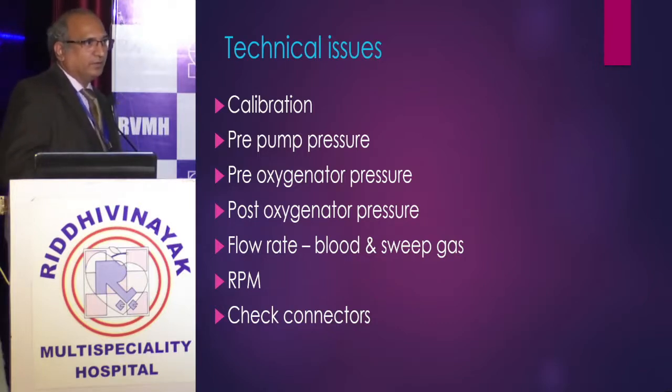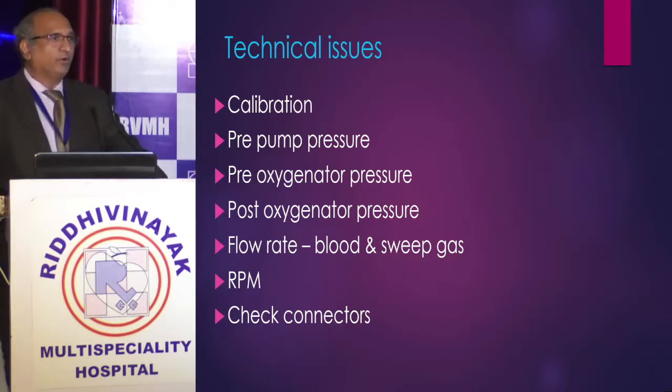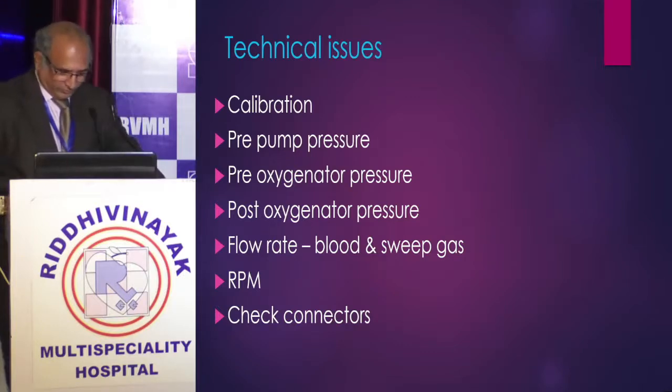So first of all, you have to always look into these parameters, and you don't wait for the investigation reports to come. These are in front of you, so you can just rule them out. If these parameters are fine, we are sure that nothing grossly related to ECMO is the issue.